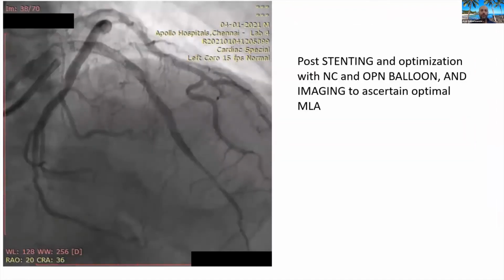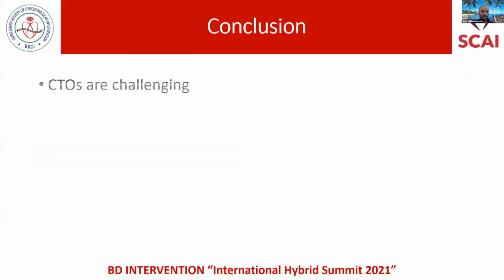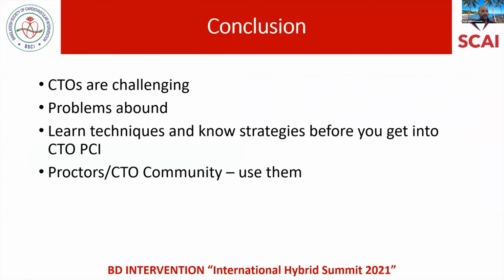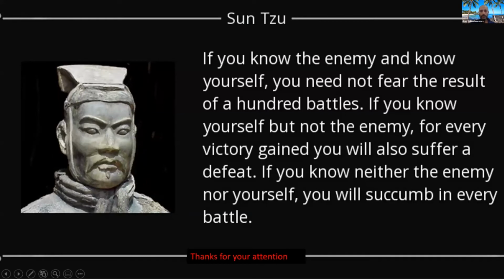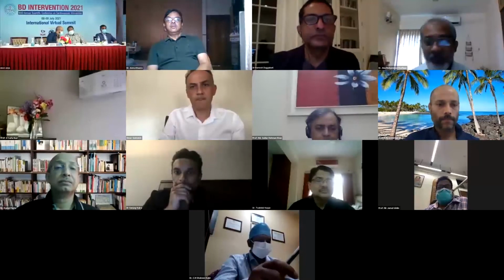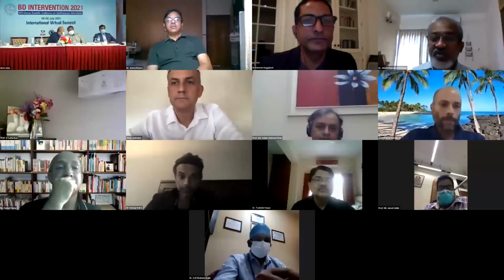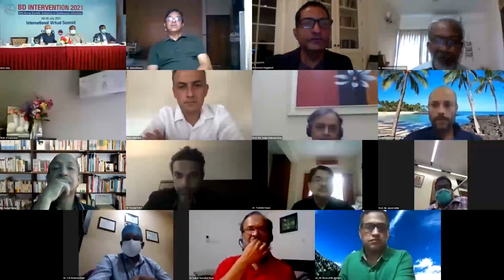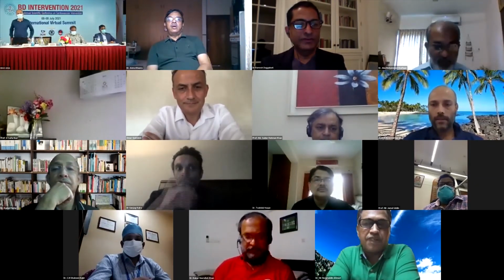In fact, one of my favorite talks is avoiding complications. I think one of the biggest reasons we draw a lot of bad press is just because of complications. I think the key with CTO operators, wherever you are on the learning curve, or even if you're a quote unquote expert, is knowing when to stop. Many times, even in the algorithm, you're running into problem, solution, and if something isn't working, you have to bail out and plan something for a later date. And that's okay.